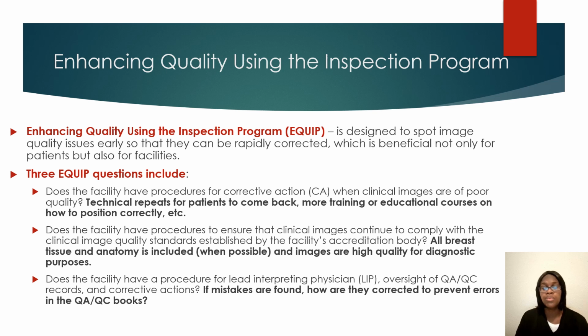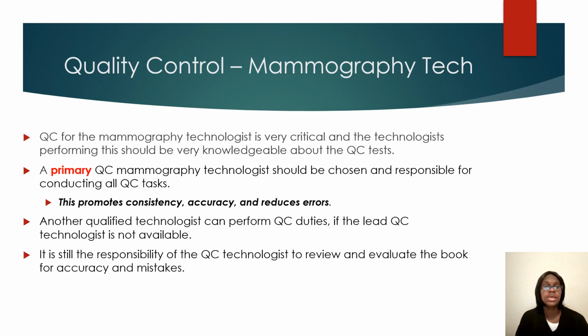Knowing what to put in place to provide more training in order to reduce the need for technical repeats, providing more training, more educational courses for the techs to learn how to take high quality diagnostic images. Make sure that we include all the anatomy whenever possible, knowing how to perform QC, QA, knowing how to notice whenever mistakes are in the QA and QC books.